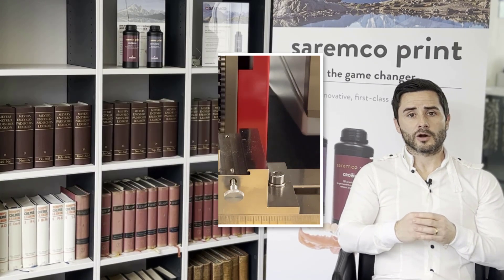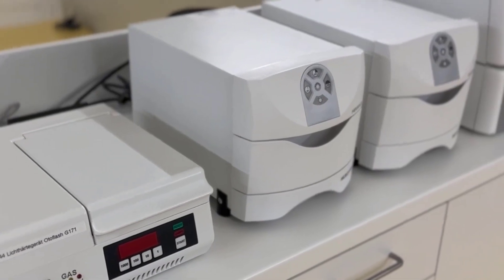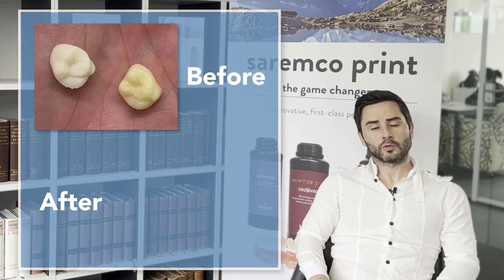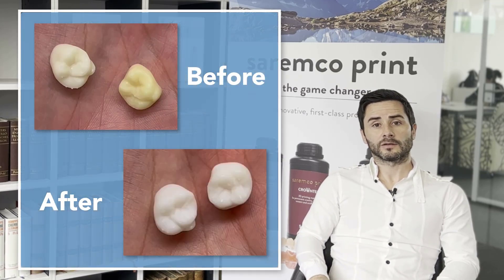Therefore our team is really looking to find the best possible outcome with each curing device. At the end the most important part are the physical properties, and we always ensure that the physical strength of the printed restoration always meets the high standards we need to have to call it a permanent restoration. To get rid of this yellowish effect when working with an LED curing unit, watch the upcoming videos together with Bastian.